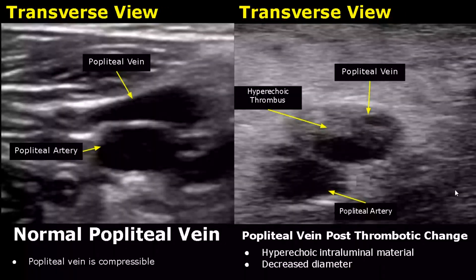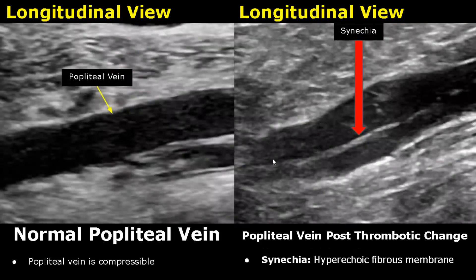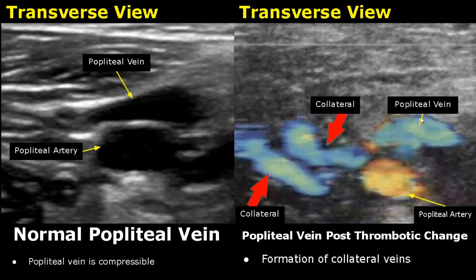In chronic cases of thrombosis, specific appearances are found. The thrombus will be hyperechoic and the vessel diameter will also be decreased. A synechia is a hyperechoic fibrous membrane that is found in chronic post-thrombotic change. In some cases, venous collaterals may form, and we can see that in this transverse view — collaterals are seen adjacent to the popliteal vein.